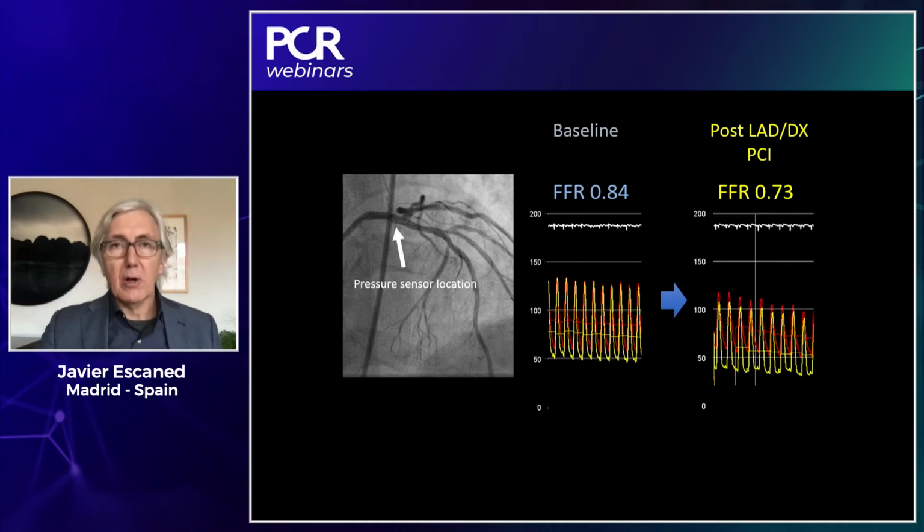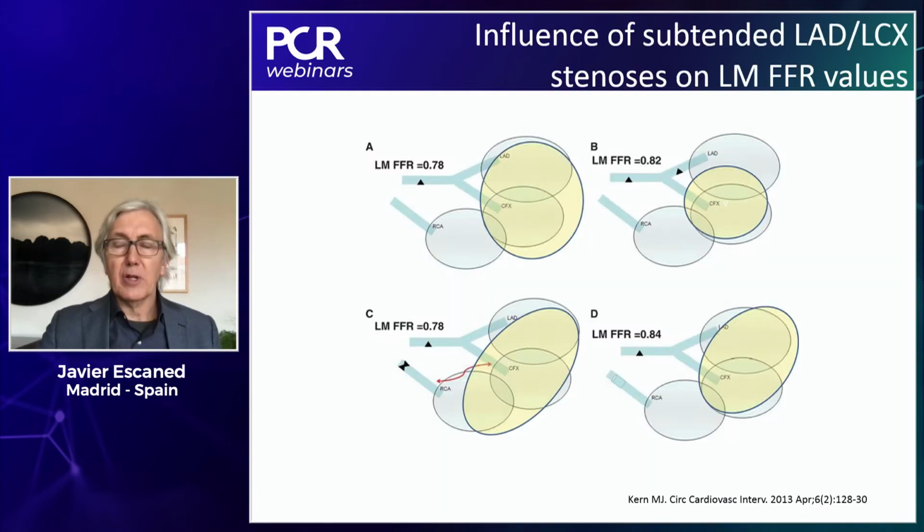So as a rule of thumb, remember, if you have a severe stenosis downstream of the left main, you have to consider to what degree they may affect your measurements in the left main.